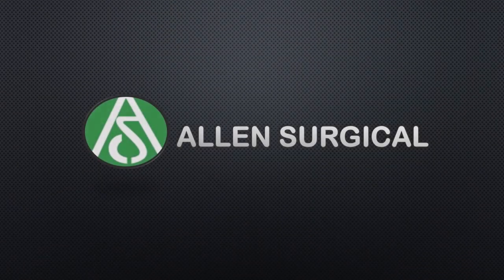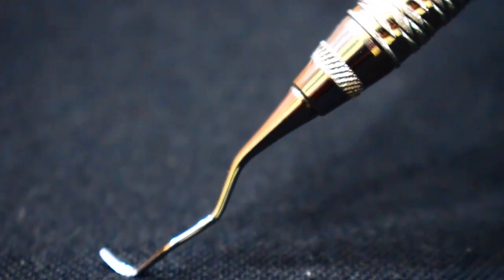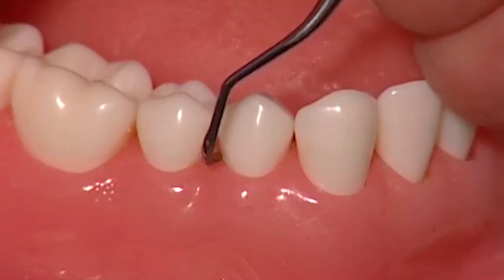Our latest line of dental curettes. Allen Surgical's Gracie Curettes are high-quality, durable, and ergonomically designed instruments made from carefully selected stainless steel.